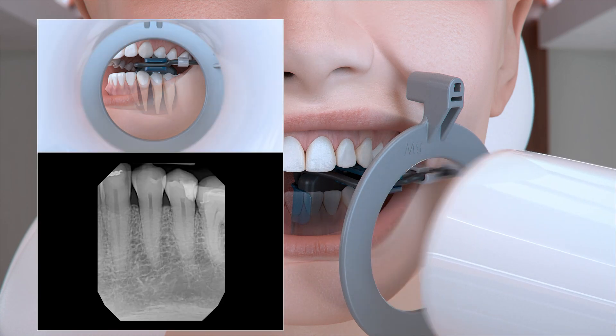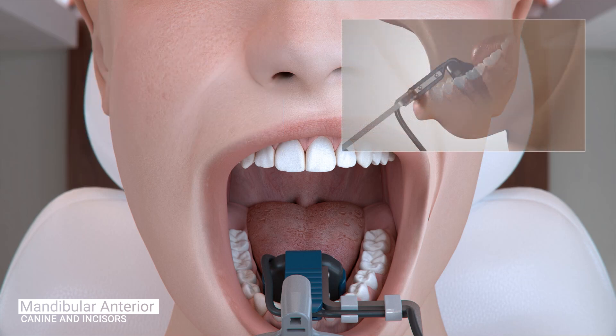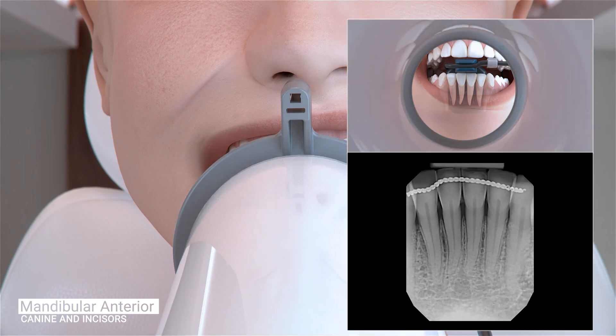Ask the patient to open and reposition the sensor to the midline for capturing the central incisors. Position the sensor so it is parallel to the roots of the teeth and as far into the patient's mouth as possible without causing discomfort, usually as far back as the second premolar. Ask the patient to close gently. Slide the aiming ring as close to the patient's chin as possible. Place the x-ray emitter cone flush with the aiming ring and trigger the exposure.